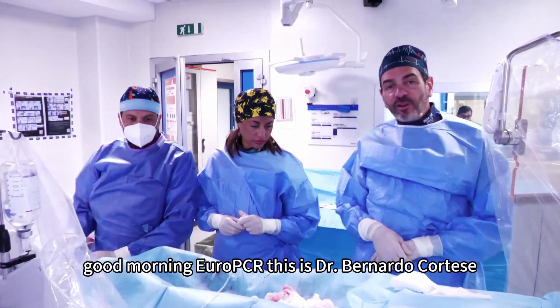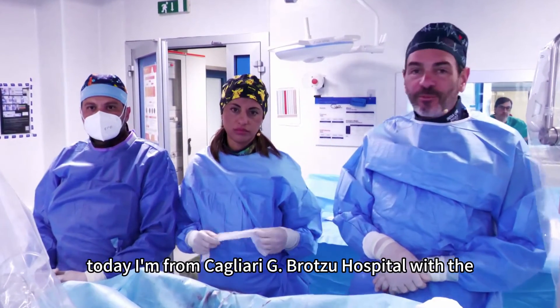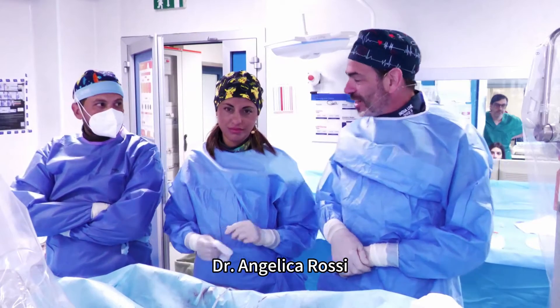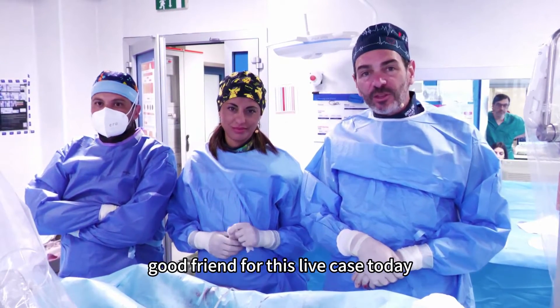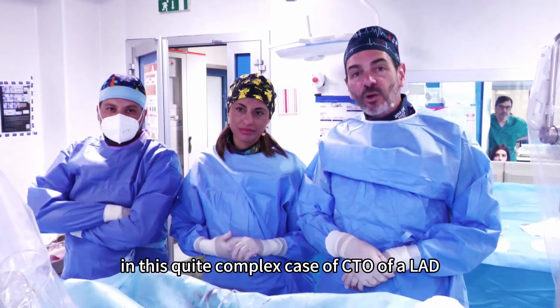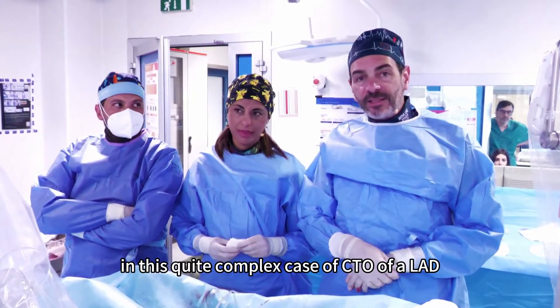Good morning, EuroPCR. This is Dr. Bernardo Cortese, today from Cagliari, Brozzo Hospital, with Dr. Angelica Rossi, a good friend, for this live case today. We are here with Serena and Massi assisting us in this quite complex case of CTO of an LAD.